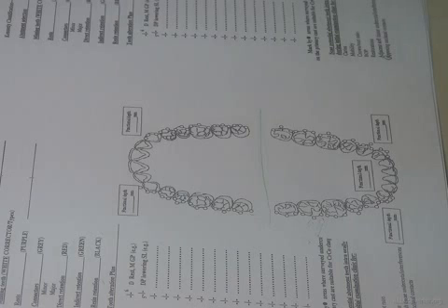We need to know. What is the main sign of active periodontal disease? Bleeding, irregular bleeding? No, it's bleeding on probing. Meaning when I insert the probe in the pocket and remove it, if it bleeds without me injuring the pocket, that means there is an inflammation deep inside. Okay? And that's where we're talking about periodontal disease. It's not seen by direct vision. You have to test for it, and you have to differentiate between previous disease and active disease.